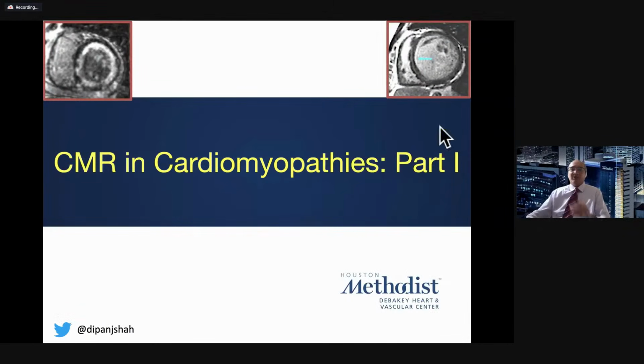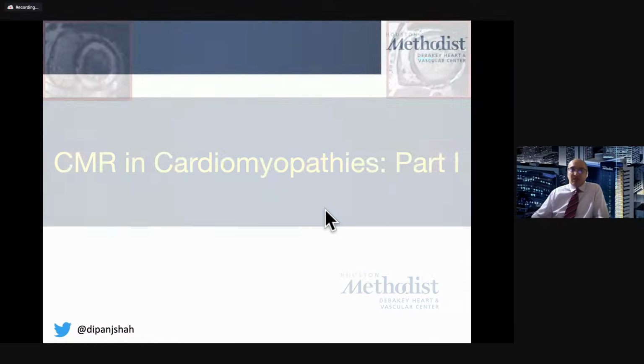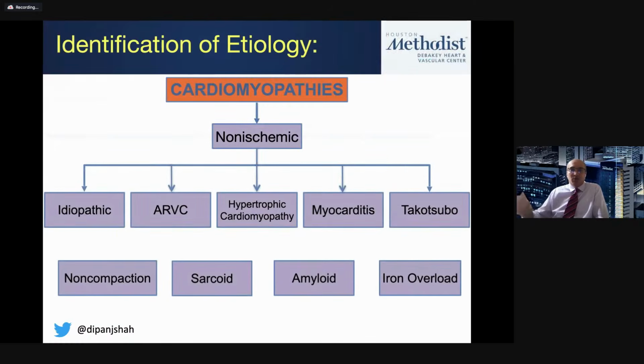There we go. Okay, so what I'm going to do today for the next half hour or so is talk about the role of CMR in various cardiomyopathies, and then we'll pick up next week with a continuation of the role of CMR, and then also incorporate the role of nuclear and PET.